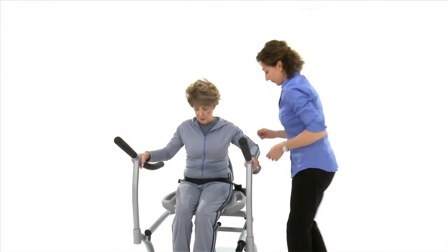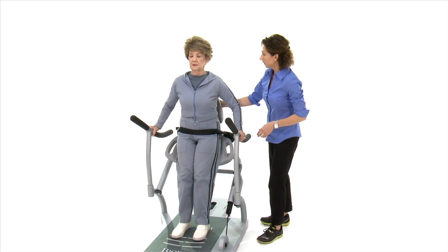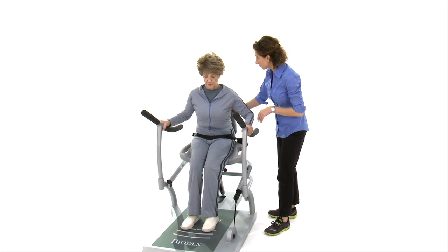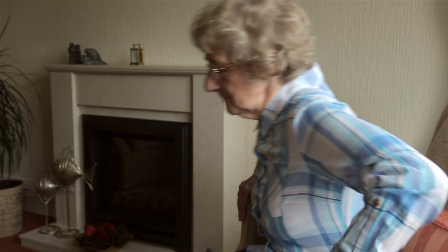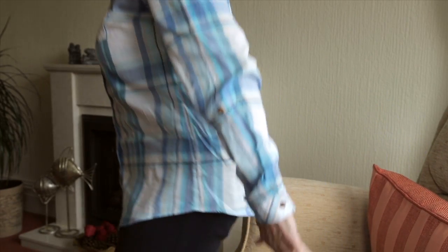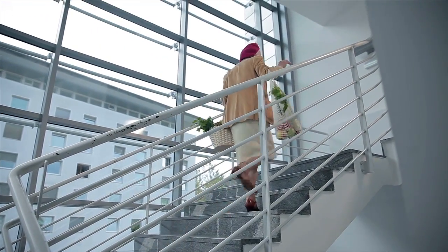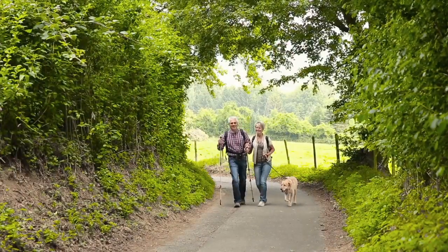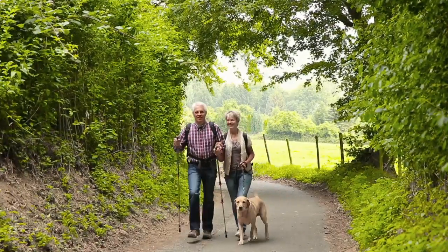Introducing the new sit-to-stand trainer, an exercise device specifically designed to strengthen the muscles used for the sit-to-stand motion. Rising from a chair takes more strength than walking or climbing stairs — it is the most fundamental movement in the mobility chain and is essential for performing activities of daily living and maintaining quality of life.